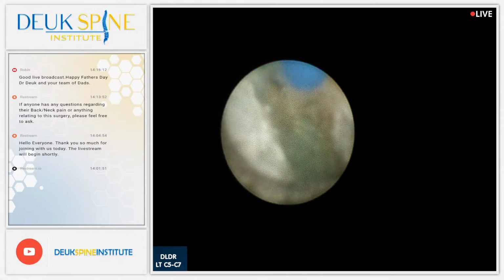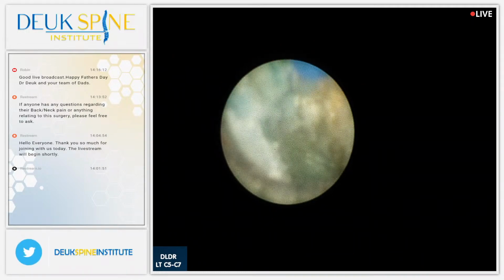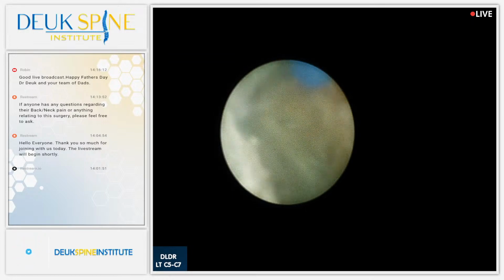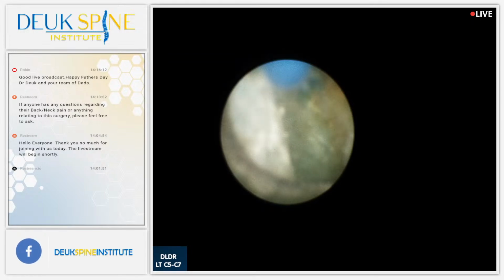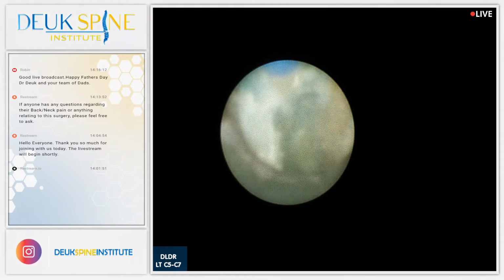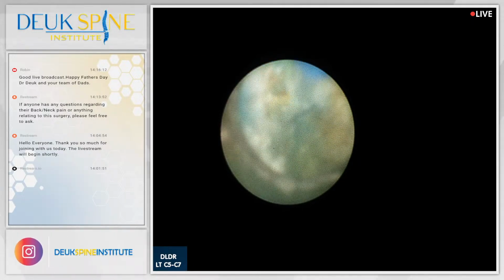And this is the tear. We're cleaning the tear right now. It's got all this schmutz in here. This shouldn't be here. This should be an empty space. But instead you've got this herniation that I'm cleaning out, and you've got scar tissue here. You can see the PLL fibers, posterior longitudinal ligament. You got a little bit of bone spur, but that's not even on the spinal cord or nerve.